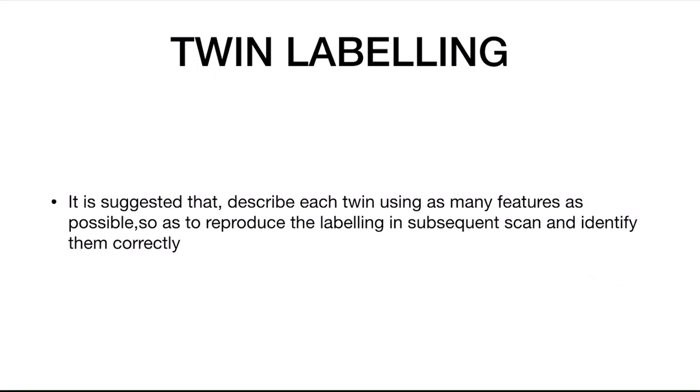So in this way you have the maximum identification features of a twin labeled. By this way, fetus A will be fetus A throughout the pregnancy, fetus B will be fetus B throughout the pregnancy, and your scans will be accurate throughout the pregnancy. The growth scans will correlate, the anomalies will correlate, and your gynecologists and pediatricians will be happy with the reporting.